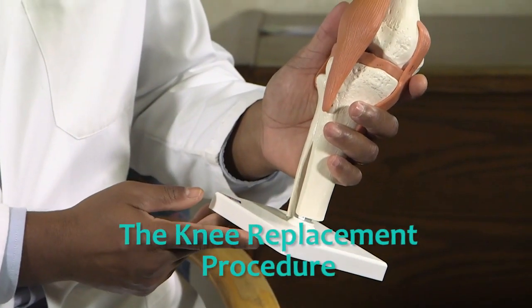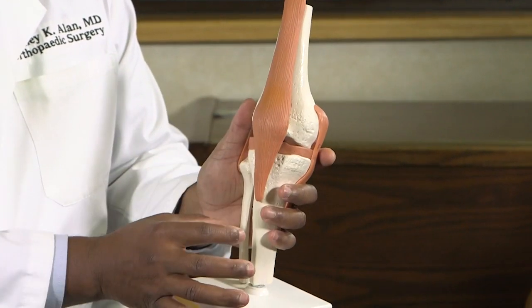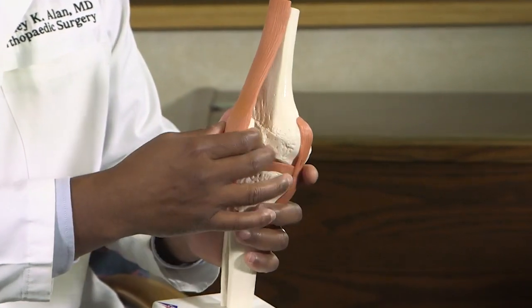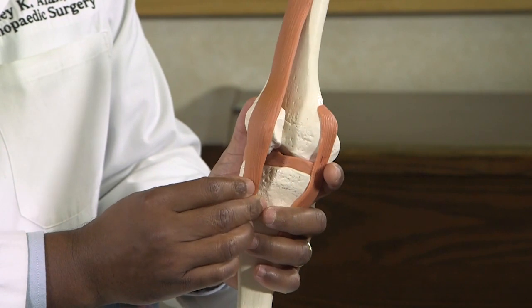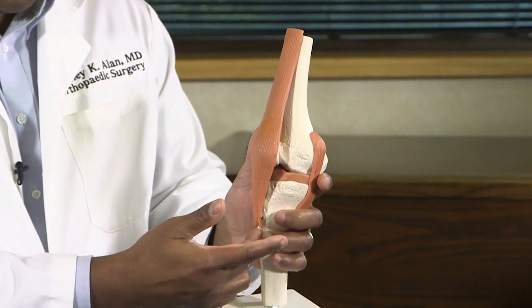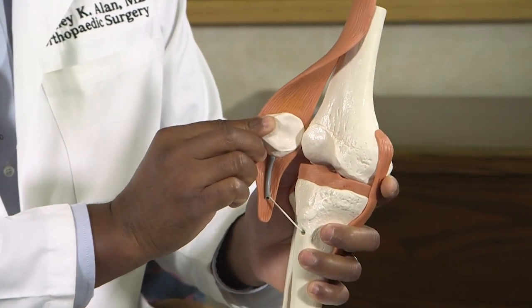This is a model of a knee joint, and it depicts the knee with the skin removed, the subcutaneous layer of fat just below the skin, and then right down to the tendon of the quadriceps muscle, which contains the kneecap, or the patella, which eventually attaches to the tibia. In the process of doing joint replacement surgery, we perform what's called an arthrotomy, which means an incision around the joint capsule, and we usually subluxate, or dislocate, the kneecap.